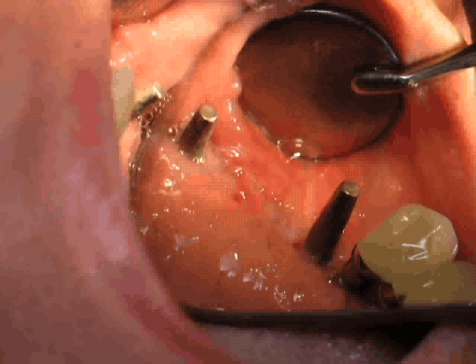So to mitigate this problem, we've decided to pull out all the stops, and we did sinus elevations, waited 6 months, and then had a custom endosteal titanium implant made so that it could accommodate 2 root forms in between. This is a 3-week post-op check on this case, and we're planning on waiting 5 months for the root form implants to heal before we restore this case.